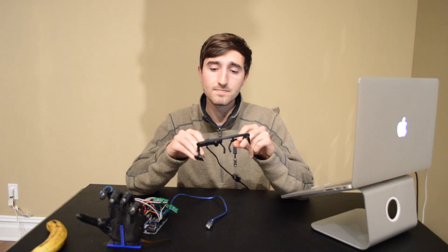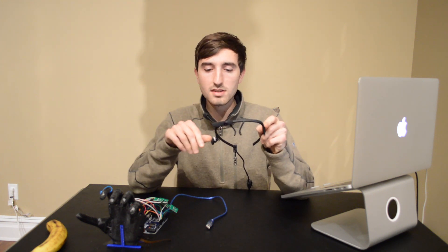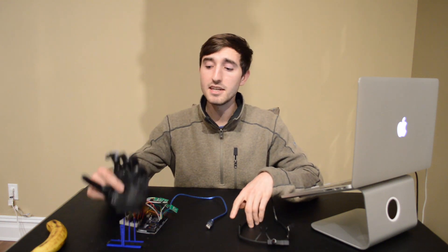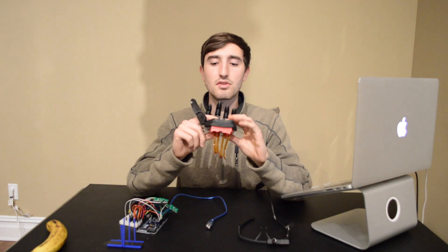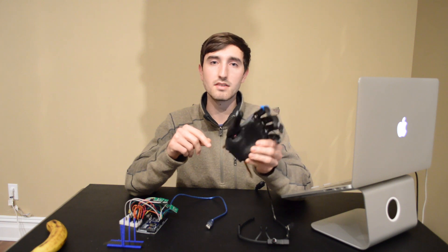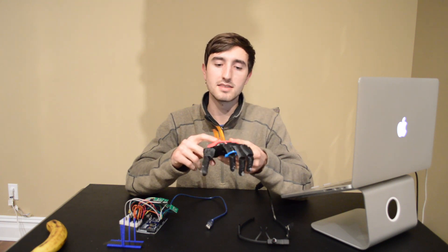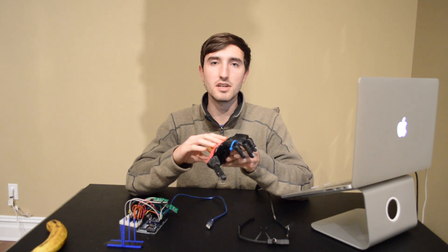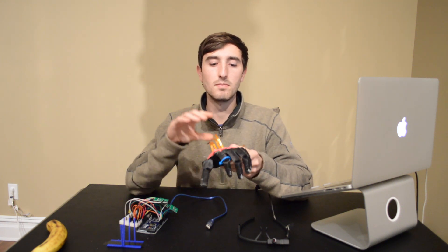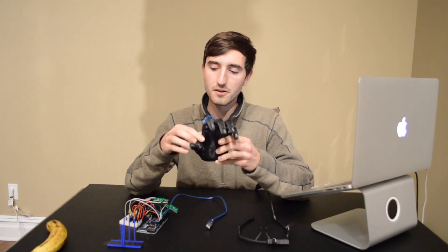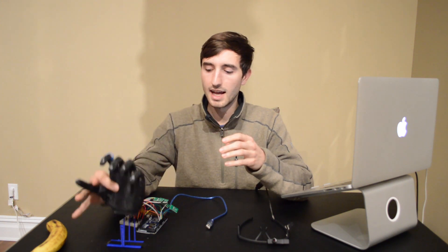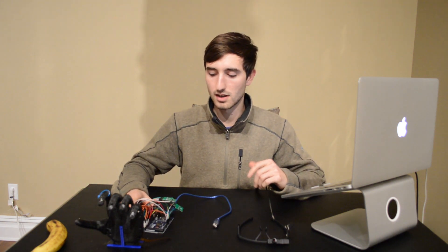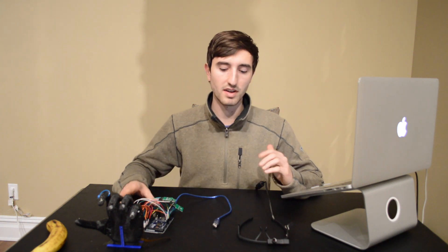So in this project, what I'm using here is a headset from Pupil Labs, which has a world camera that perceives the world and your field of view and another camera that is tracking your eye. And here I'm using a 3D printed flexible hand. It's an open bionics design with five linear actuators, one linear actuator per finger, and that will be controlled using your standard Arduino Mega 2560.